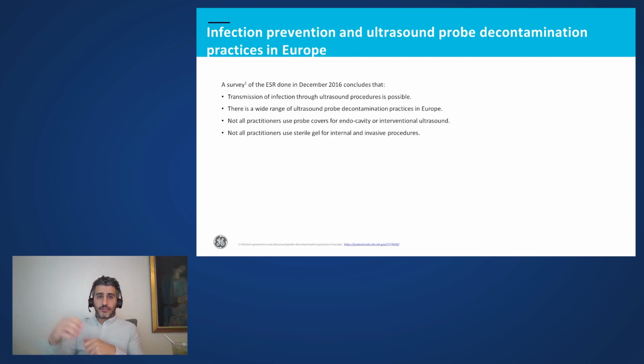In December 2016, there was a survey published by the European Society of Radiology. In this survey, you could read, for example, that not all medical professionals are using probe covers or sterile gel, even for procedures where they should actually be using them.